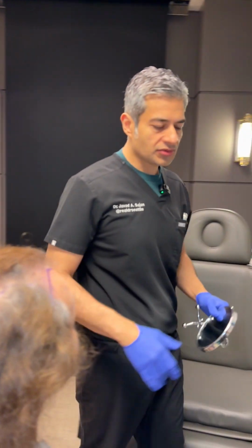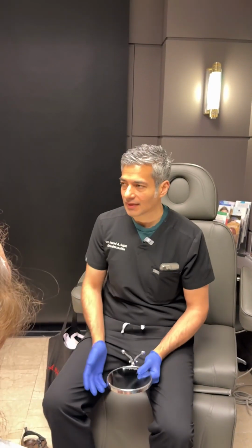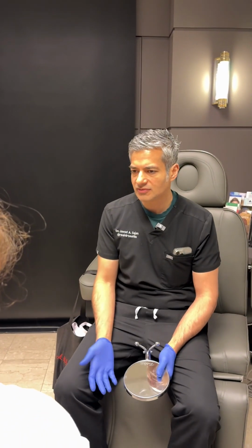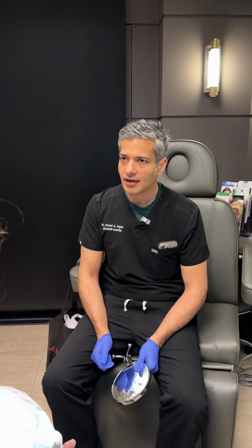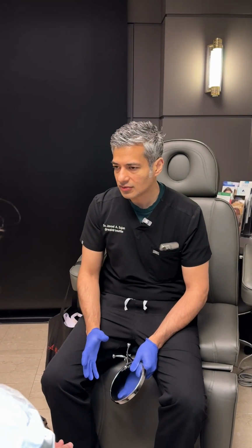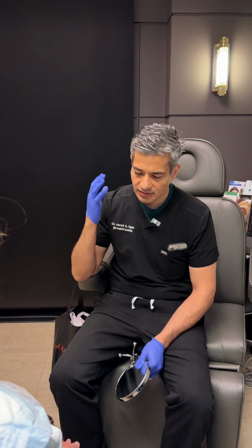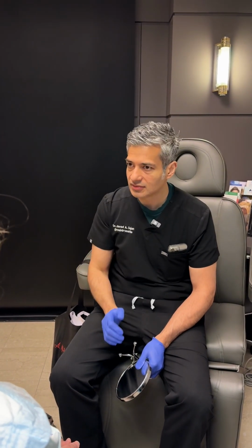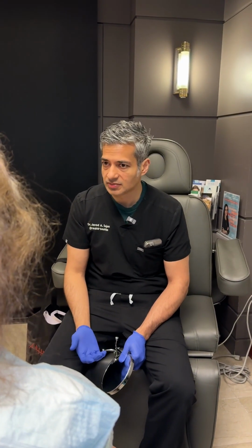With each session, we can do 3,000. That's the most our team can do in one session, which I feel is a lot. It's 3,000 follicles, but each follicle has between 1 and 6 hairs. So you'll end up with more than that. Our goal today is to give you more thickness, more fullness, and make you more comfortable. We're going to focus on filling in the peaks that you don't like, making the front a little bit thicker and reinforcing the hairline, and filling in the crown as much as possible.